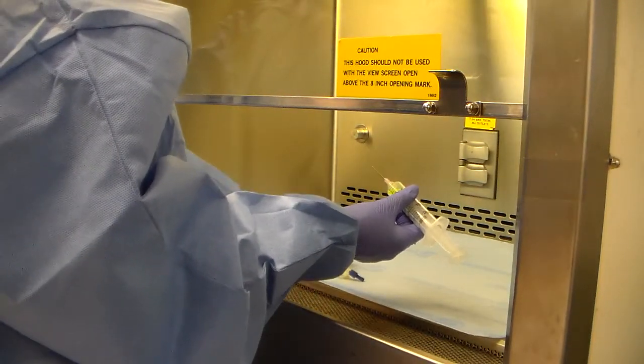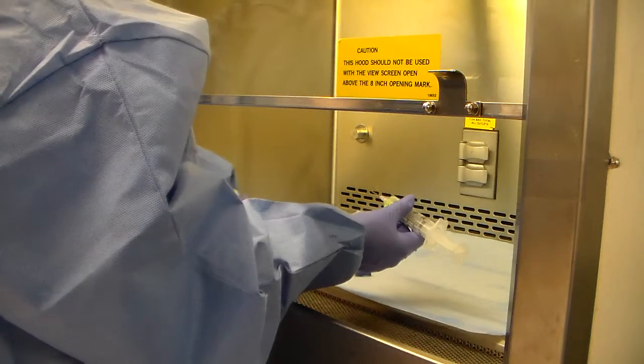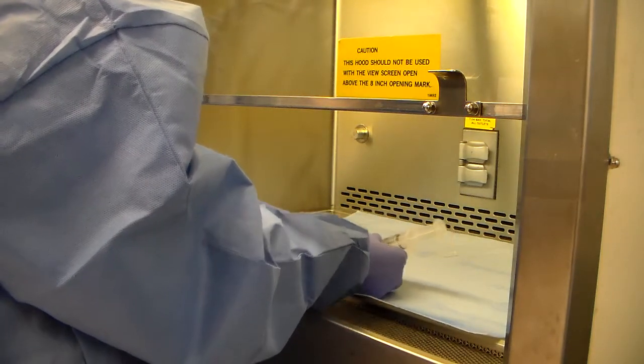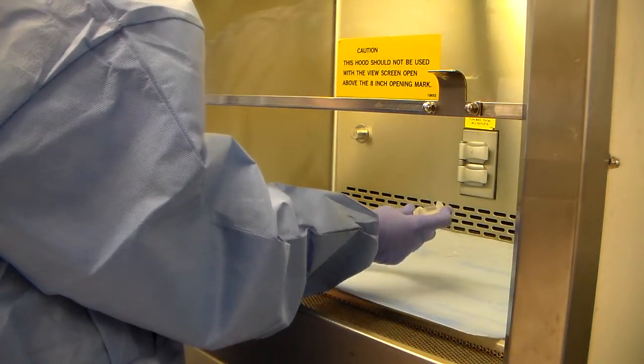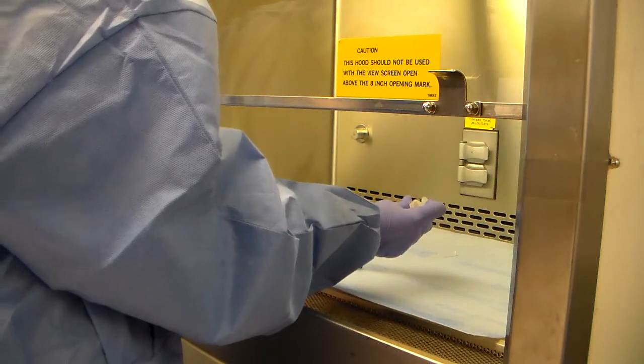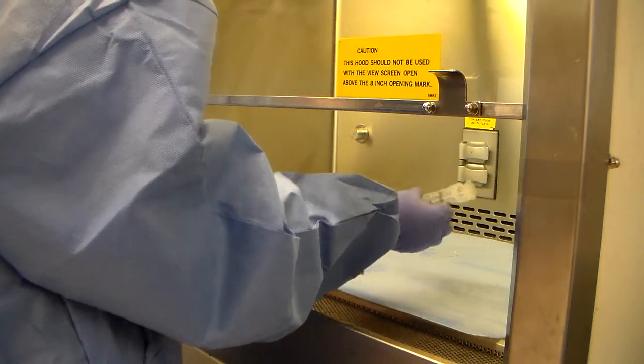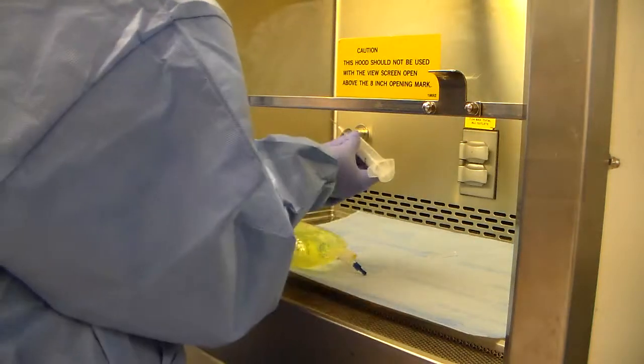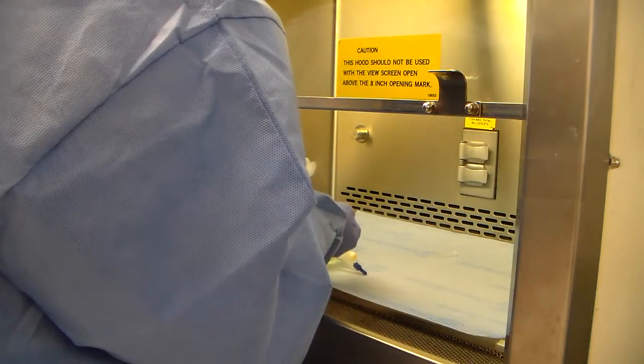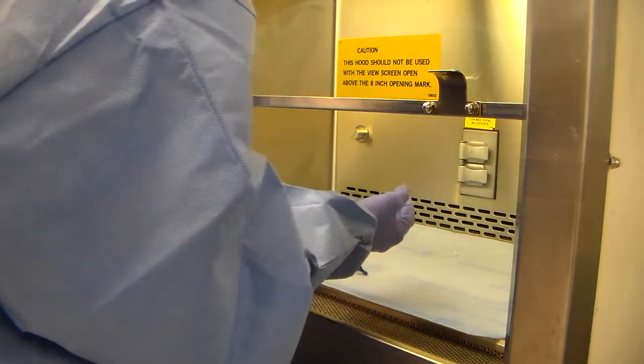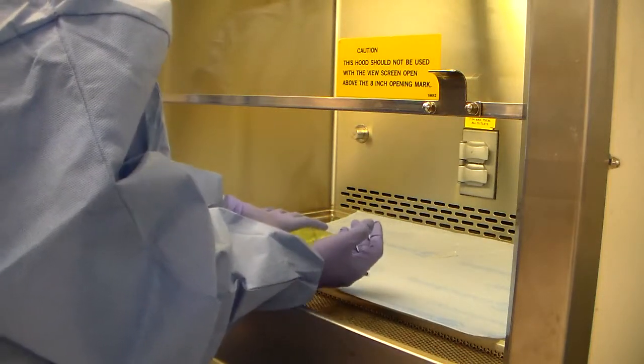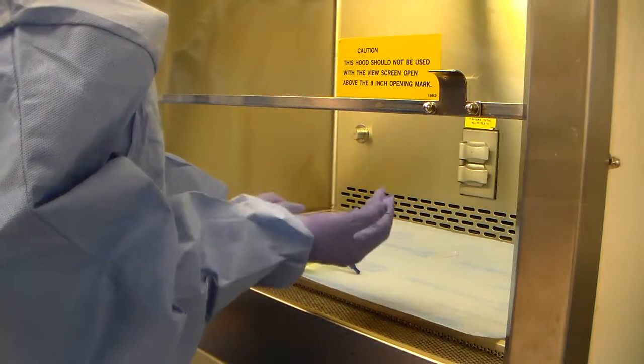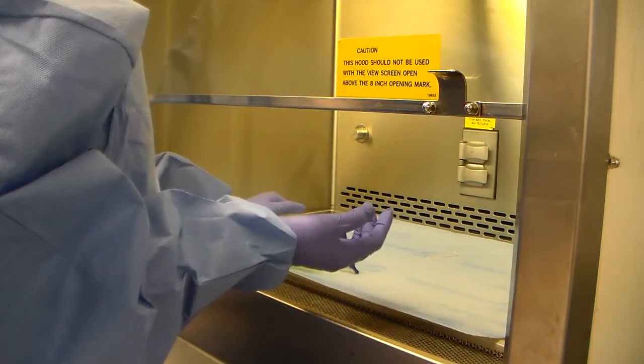Then I'm going to go ahead and apply pressure to this Y IV port like we've been doing. Bevel up. And we inject the medication and the air. The whole thing goes in there. Then my pharmacist is going to come again and grab this from me. And they will dispose of that for you. So that's what I meant by they're literally standing right next to you each time and they dispose your products for you.